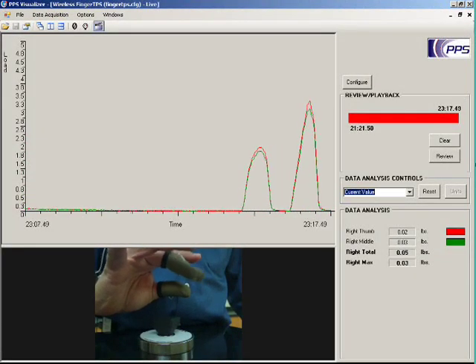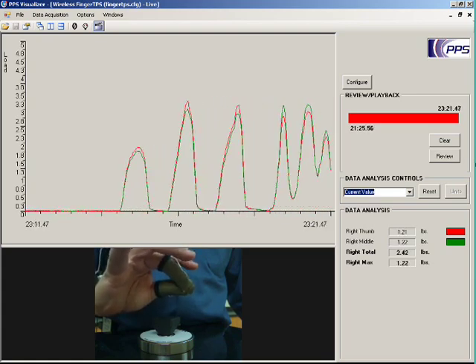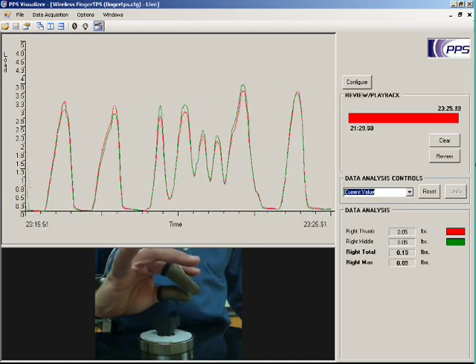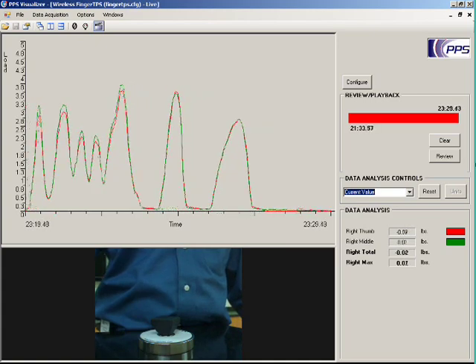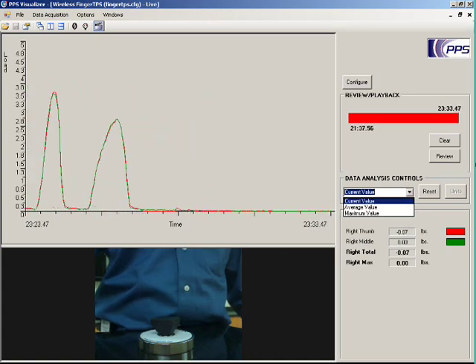The integrated synchronized video feature of the PPS software allows you to correlate user actions with sensor data. For each hand, the software will display the total and maximum force. You also have the option of viewing the current, average, or maximum value of each sensor over time.